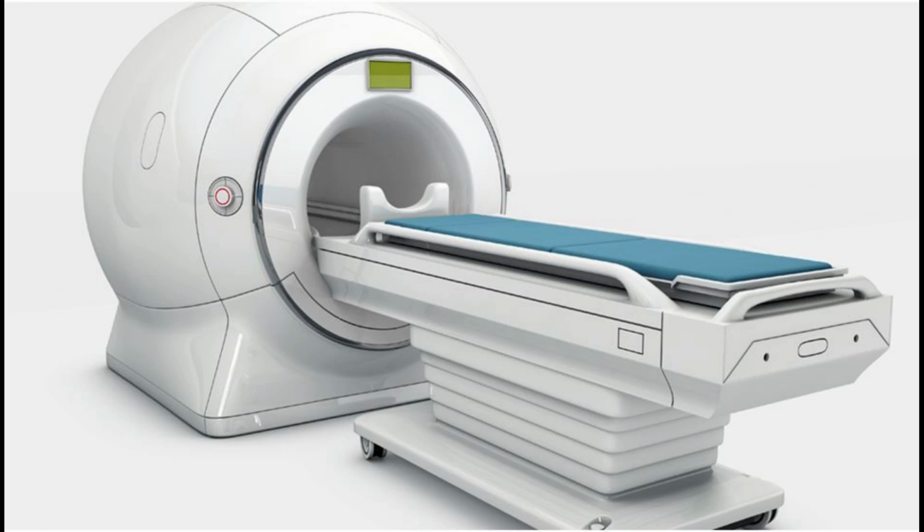MRI also is used in guided stereotactic surgery and radiosurgery for treatment of intracranial tumors, arteriovenous malformations, and other surgically treatable conditions using a device known as the N-localizer. New tools that implement artificial intelligence in healthcare have demonstrated higher image quality and morphometric analysis in neuroimaging with the application of a denoising system.